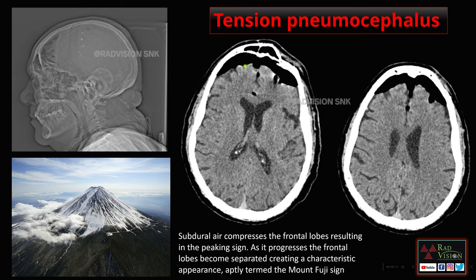On the axial CT sections, you can clearly see there is free air which is causing compression of the frontal lobes and also causing separation of the frontal lobes from the calvaria. This free air is also extending along the falx, causing compression of the frontal lobes — this is nothing but a classical case of tension pneumocephalus.